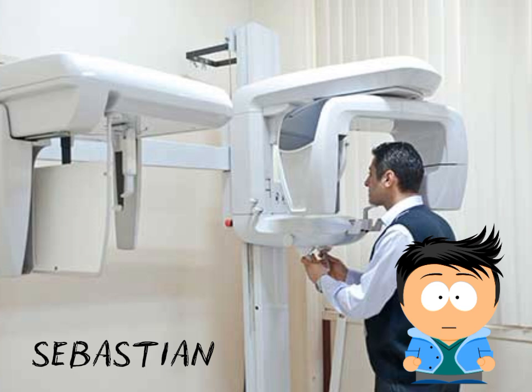The sensor is exposed to create an image. The advantages are broad coverage and low radiation, between 4 and 7 microsieverts.